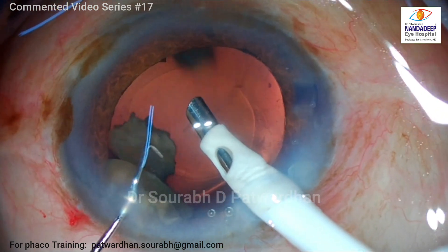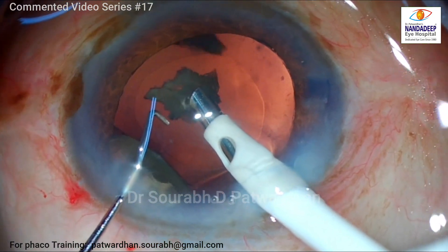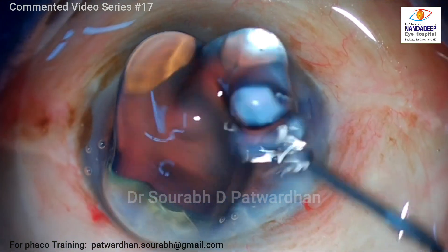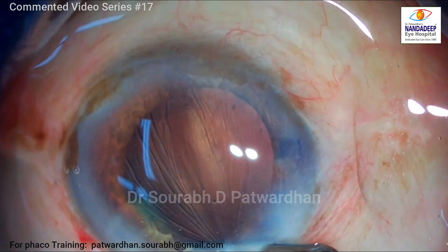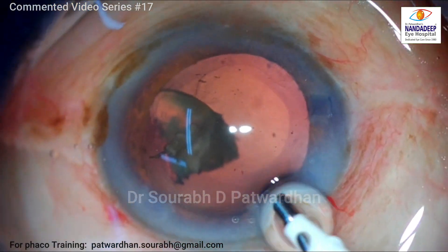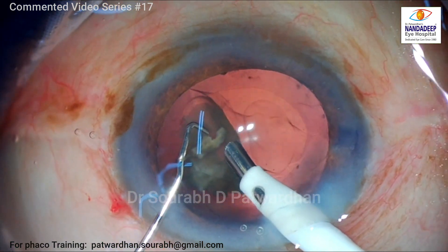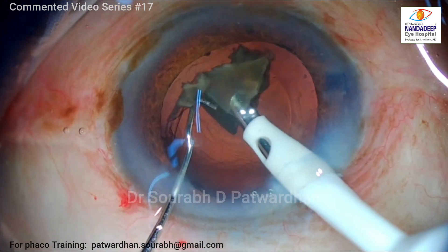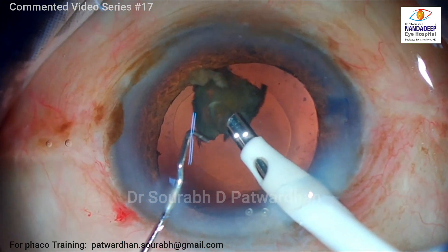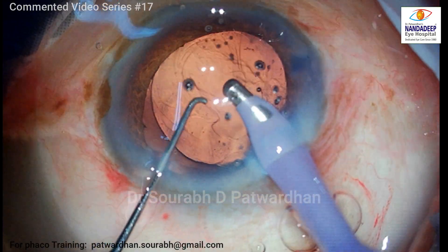Make the settings as safe as possible for every eye. Do watch my video on how to set phaco parameters on YouTube — I think it will give you the insights. There is only one piece remaining, so I decided to come out and replenish the viscoelastic, then push that piece to the centre because I don't want to maneuver it in the periphery. I have already coated the endothelium with Hilu coat, so I am not worried about any endothelial issues — the Hilu coat is still coating the endothelium. For this last piece I am using the same parameters, with vacuum lowered slightly to 270. The anterior chamber is very stable and I am doing phaco emulsification at the iris plane.